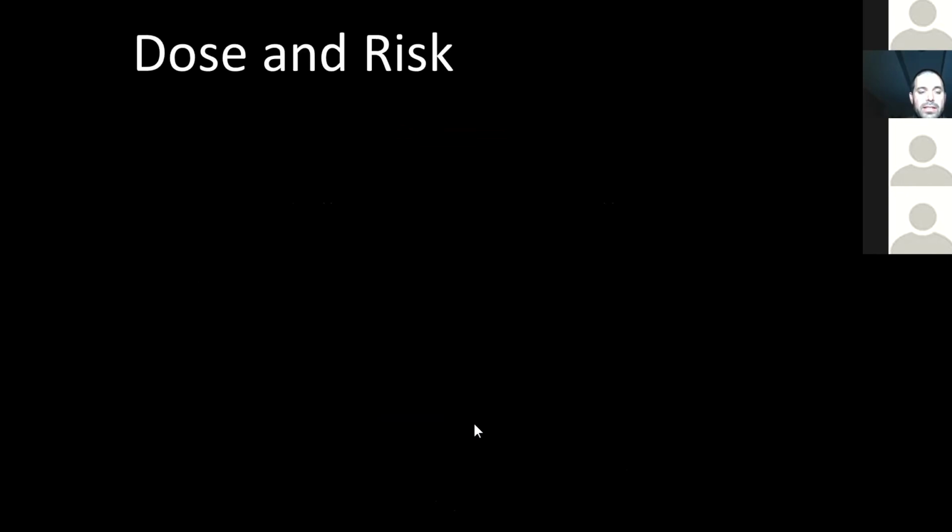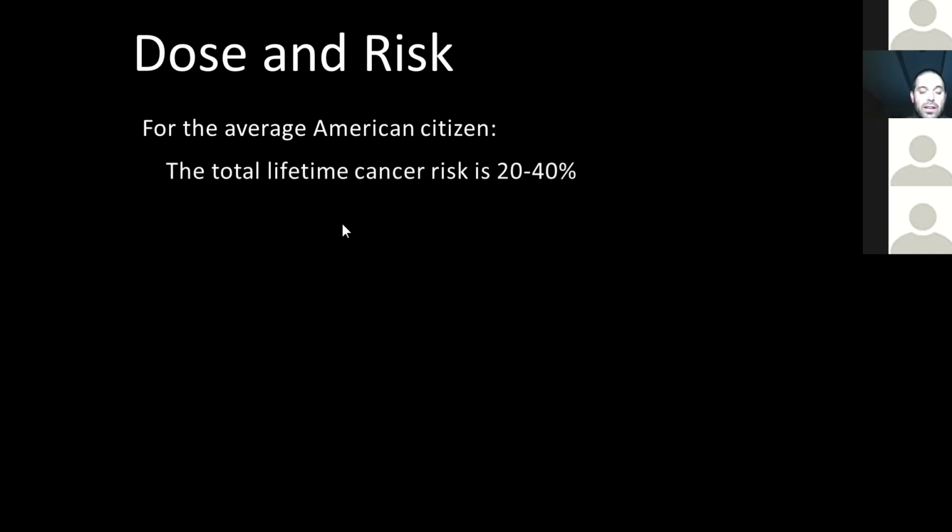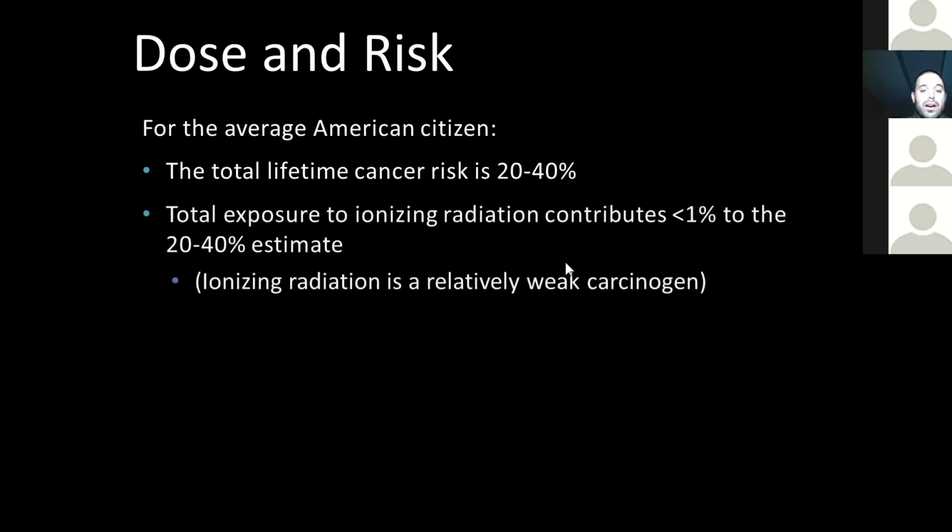Now, let's tie dose to risk. And again, I stated earlier that our main and only relevant risk for use of X-rays in dentistry is risk of cancer later in life. So let's take our same average American citizen. Our total lifetime cancer risk is 20 to 40%, which is a pretty staggeringly high number. And if we select from that and look at what number of cancers come from ionizing radiation, it contributes less than 1% to that 20 to 40% estimate.